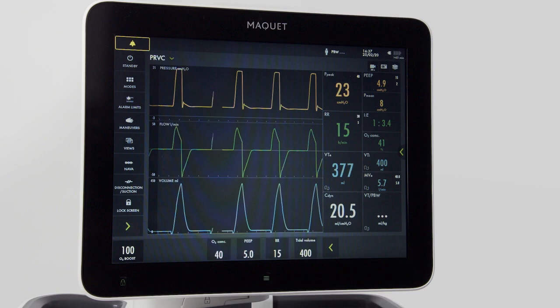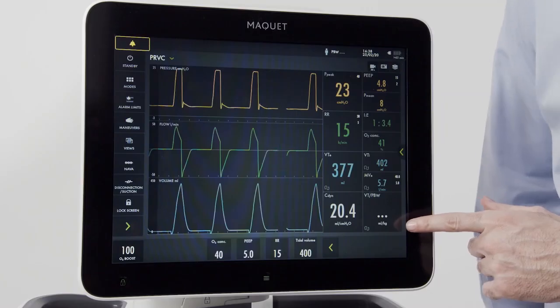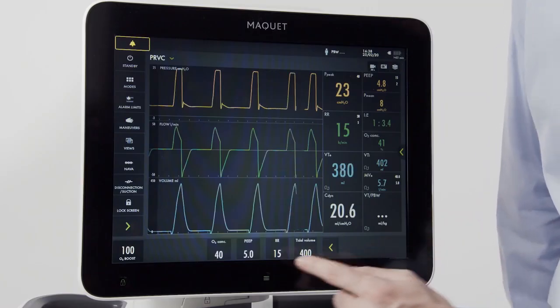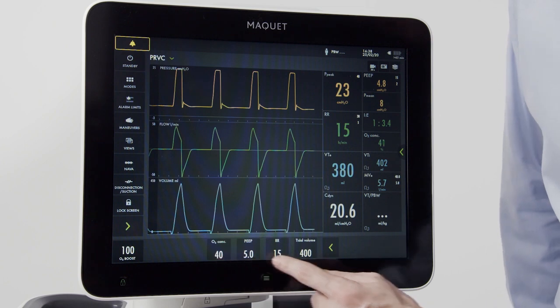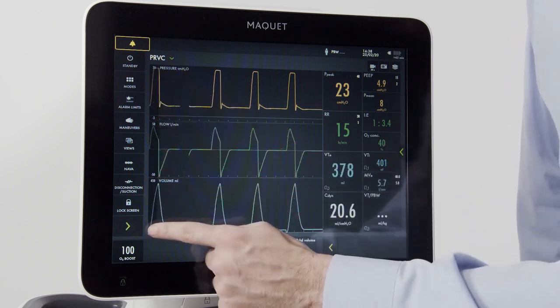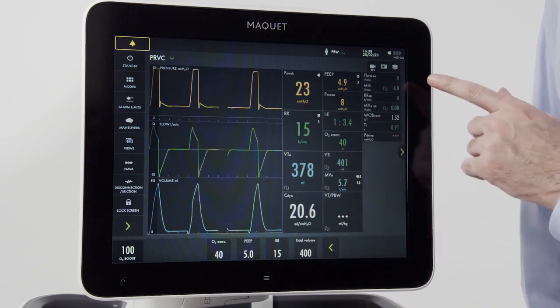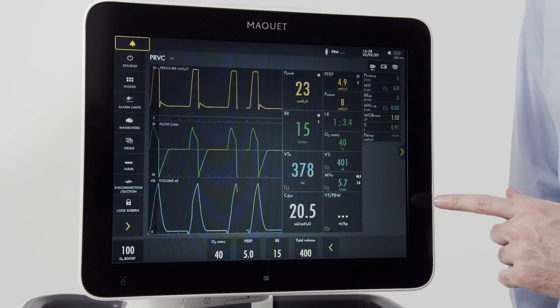Now that we're ventilating, let's get familiar with the user interface. On the right side of the ventilator, I can see all my measured parameters. At the bottom, I can see my set parameters. Over here are my menu buttons. When I press the green arrow, I can see all the parameters that are measured in this mode.